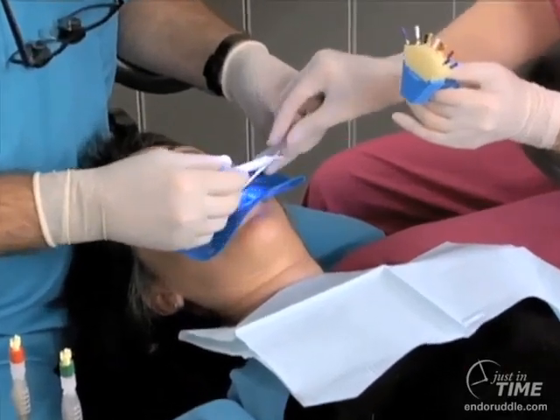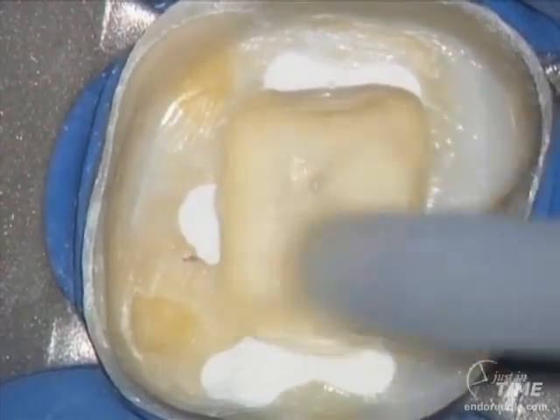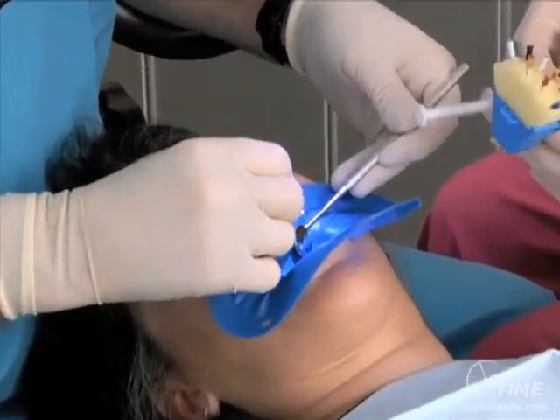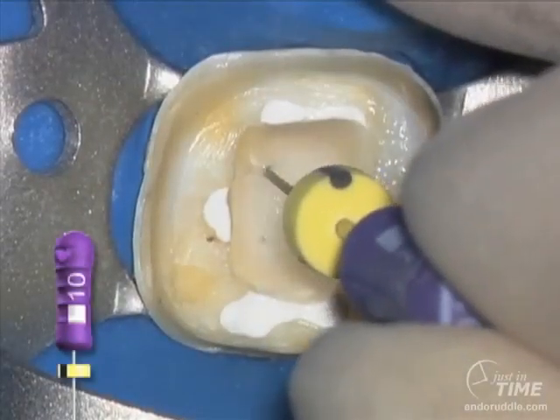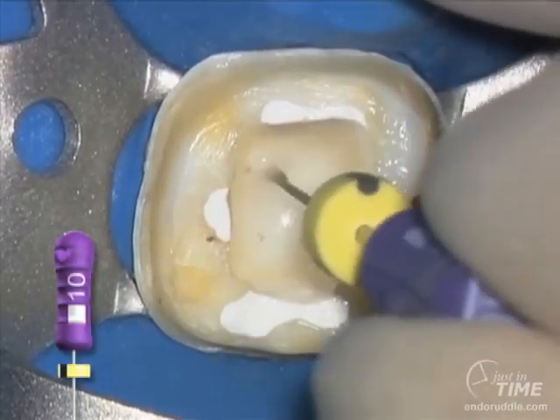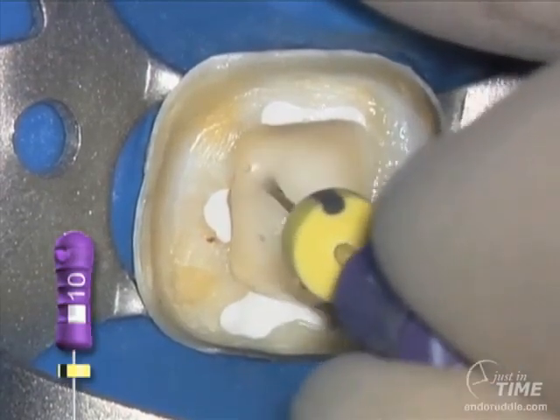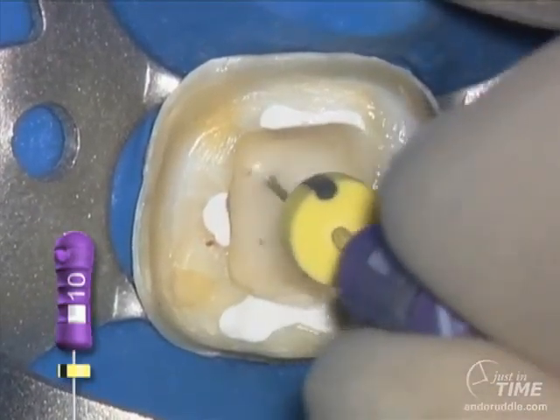So when we have the tooth isolated in profound anesthesia, we would syringe in ProLube, Glide, or RC Prep, and we would begin thinking about creating a coronal 2/3 glide path. There's no preconceived notion where any of these instruments go. Wherever they go is where they go.